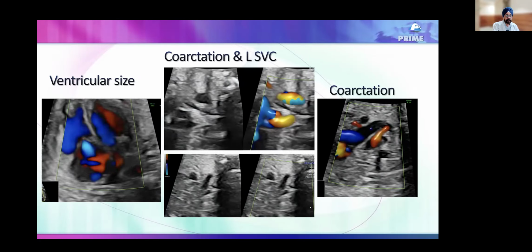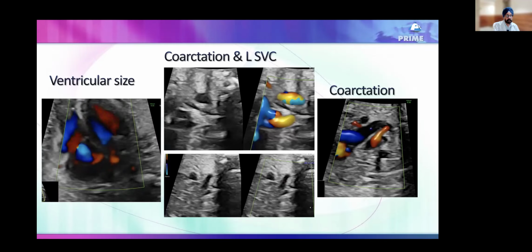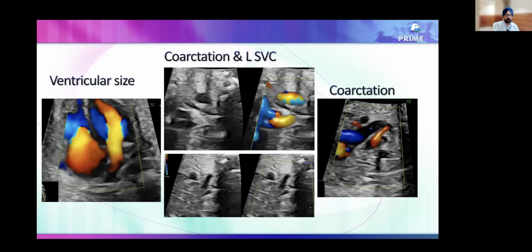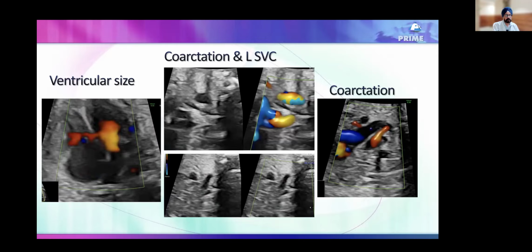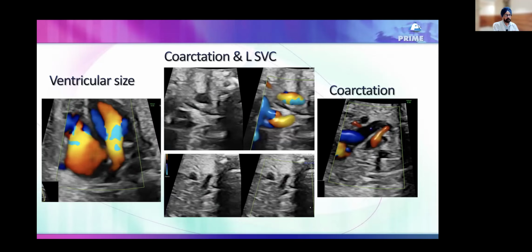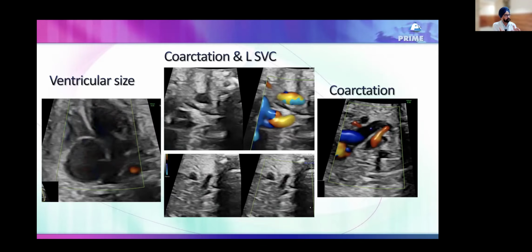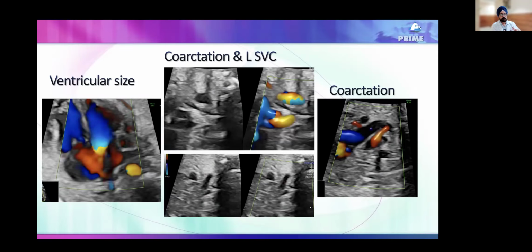The RA and RV are slightly larger. The reason given for that is that when there is a dilated coronary sinus, it affects the fossa ovalis streaming the blood to the left atrium. There are very special streaming techniques through the fossa ovalis flap and the eustachian valve.